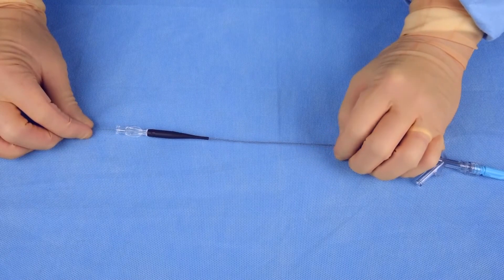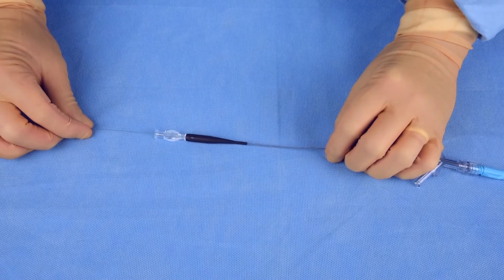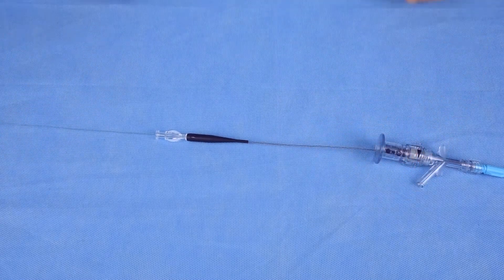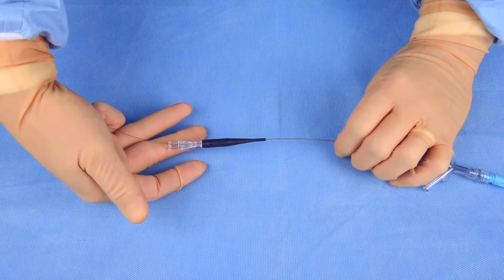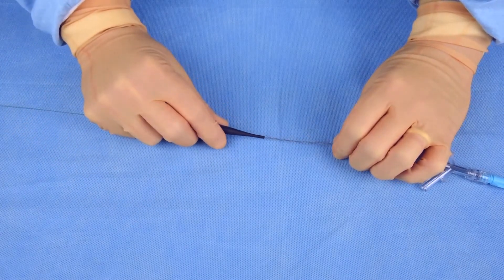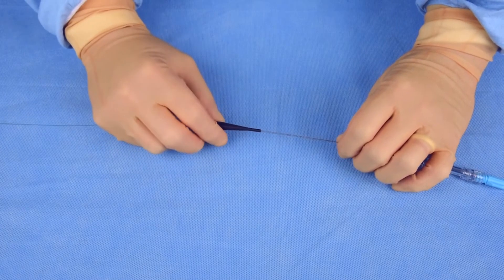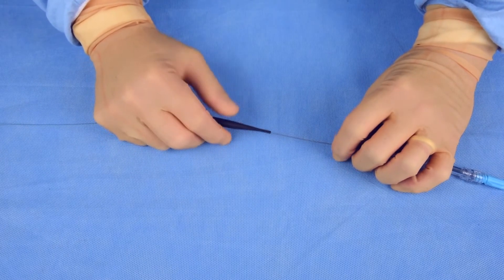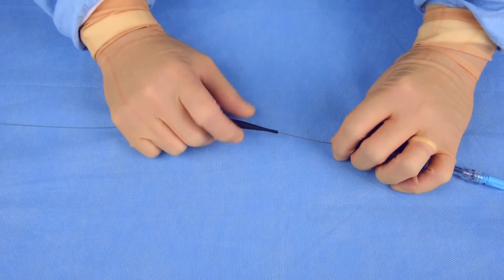Carefully advance the turnpike catheter through the vasculature under fluoroscopy. As resistance is encountered while advancing the catheter through the vessel under fluoroscopy, fix the guide wire in your pinky finger of your right hand. Then, rotate the catheter with your pointer finger and thumb in either a clockwise or counterclockwise direction while gently pushing on the catheter with your left hand to advance.